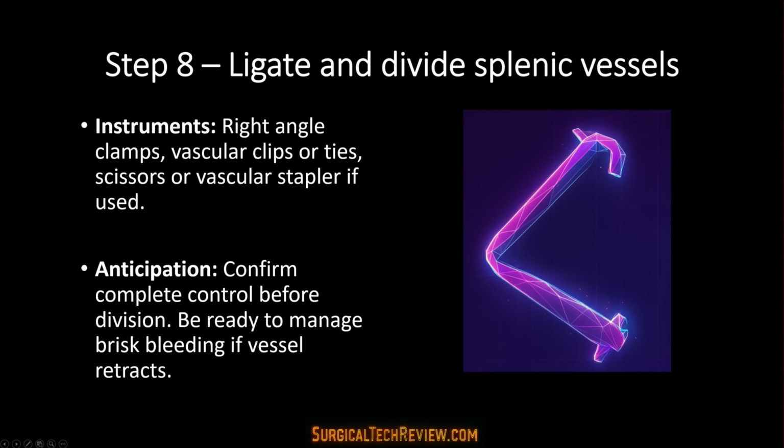Step 8. Ligate and divide splenic vessels. Instruments include right angle clamps, vascular clips or ties, scissors, or vascular stapler if used. Anticipation: confirm complete control before division. Be ready to manage brisk bleeding if vessel retracts.